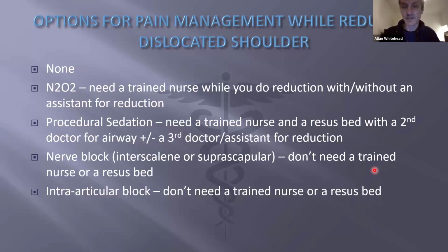And the good news for that is you don't need a trained nurse. You can do the block, and you don't need a resuscitation bed, and you can wait for it to work, and then you can come back and do the manipulation either on your own or with an assistant.